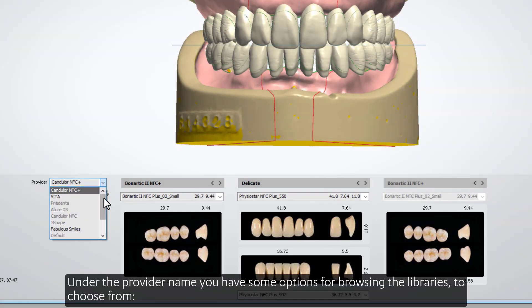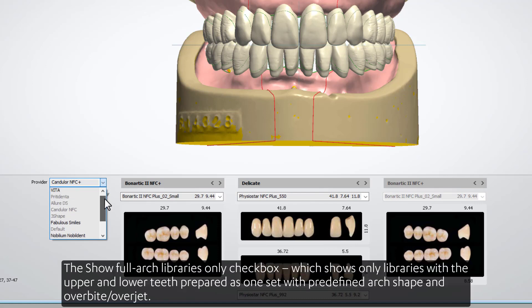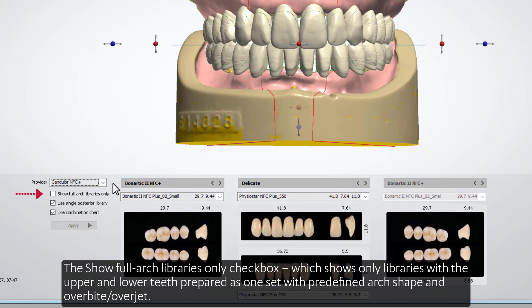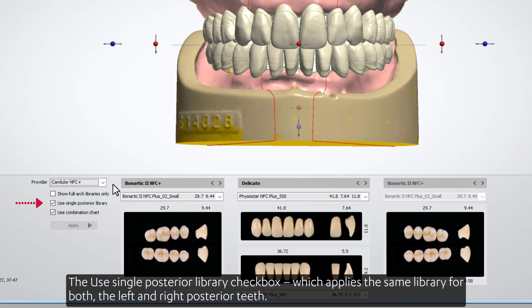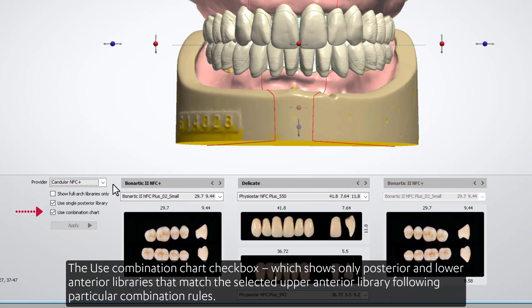Under the provider name, you have some options for browsing the libraries. The Show Full Arch Libraries Only checkbox shows only libraries with the upper and lower teeth prepared as one set with predefined arch shape and overbite/overjet. The Use Single Posterior Library checkbox applies the same library for both the left and right posterior teeth. The Use Combination Chart checkbox shows only posterior and lower anterior libraries that match the selected upper anterior library following particular combination rules.